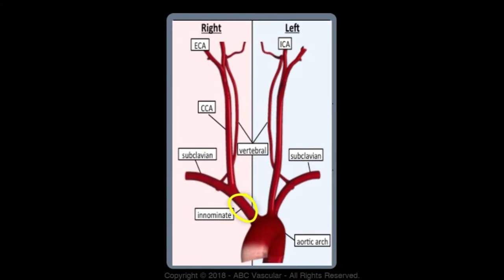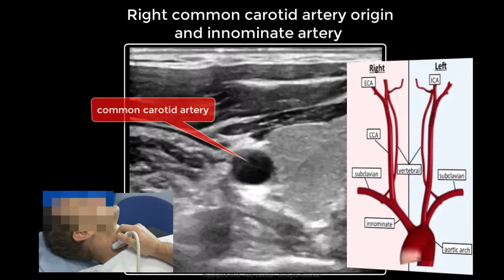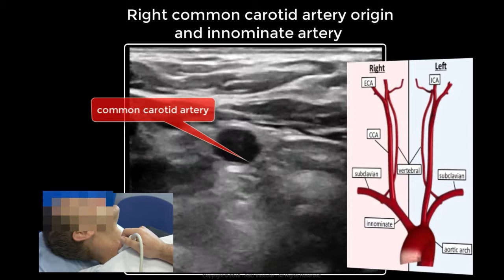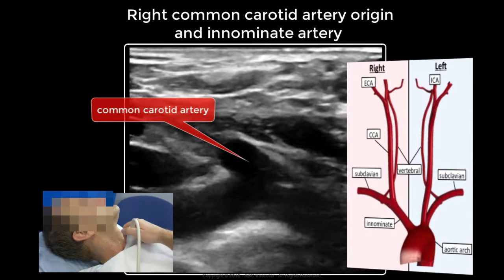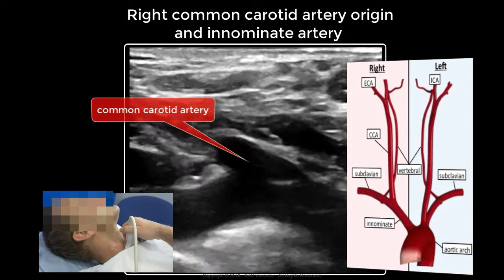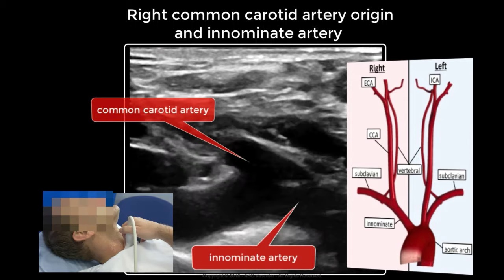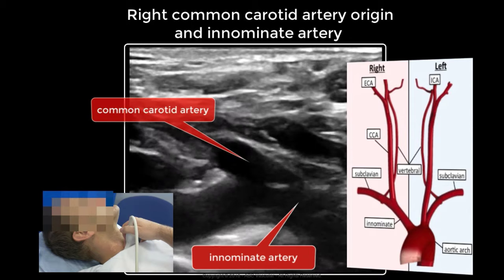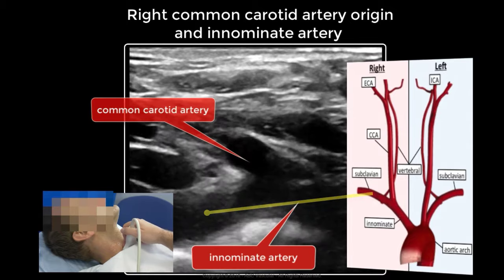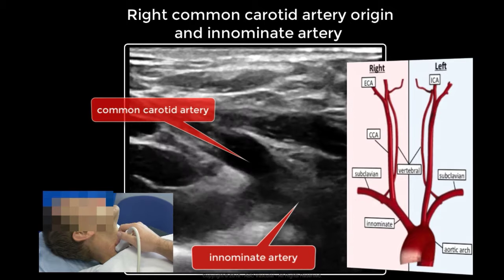While the origin of the common carotid artery can often be visualised using ultrasound, the left common carotid artery origin may not be visualised for anatomical reasons. Starting from the right side, once the common carotid artery has been identified in transverse view, move the transducer down towards the very base of the neck, angling the transducer downwards. At the base of the neck you can visualise the innominate artery — a large vessel that arises off the aortic arch and divides into the common carotid artery and the subclavian artery — and therefore the origin of the right common carotid artery can be identified.